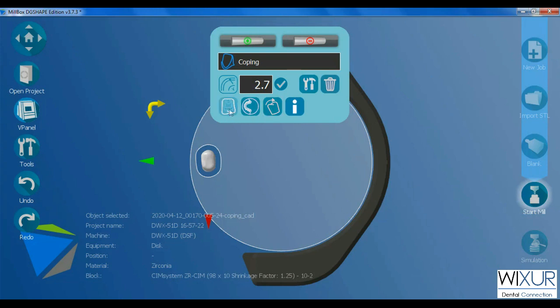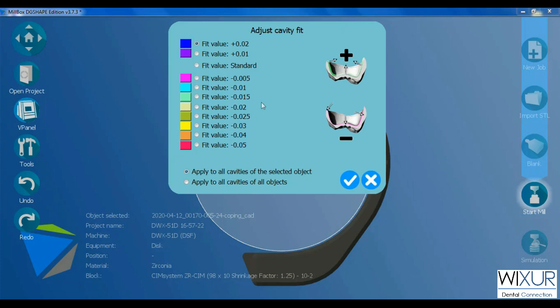The most important option is for adjusting the cavity fit. By default, the fit value is standard. I can tighten the crown by selecting a positive number and loosen it by selecting a negative number.